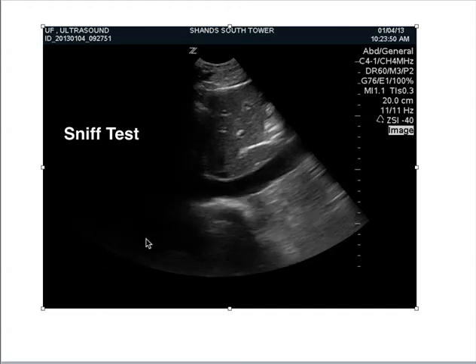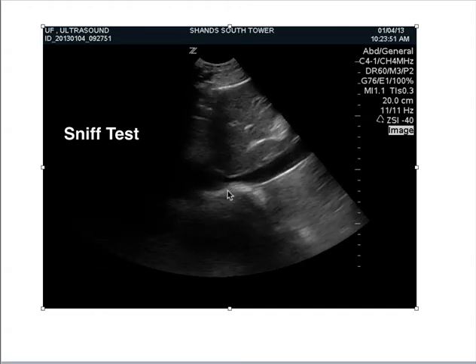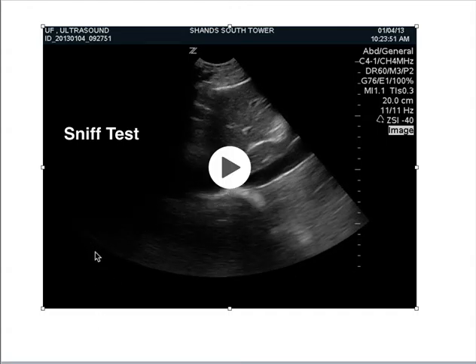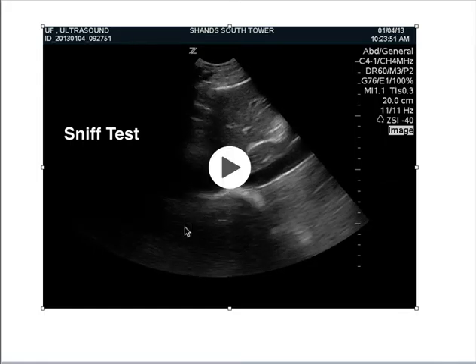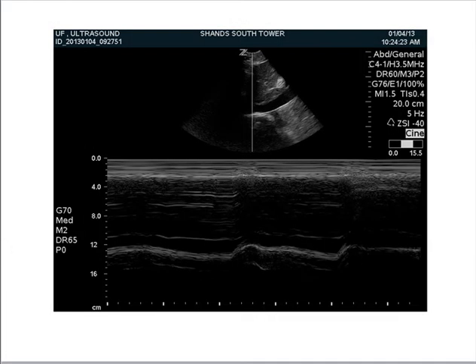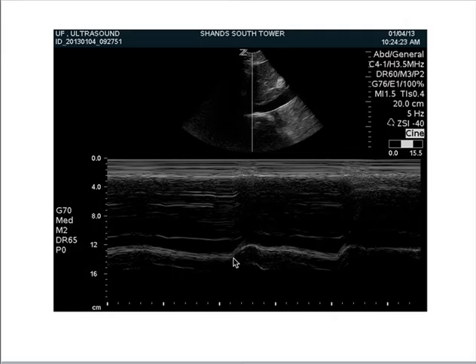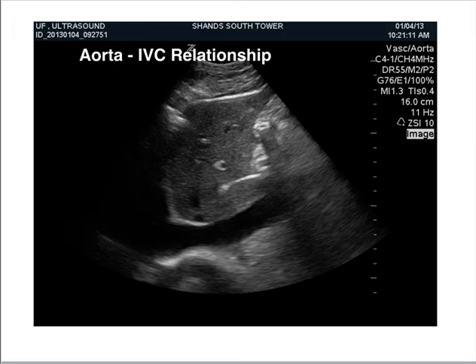Here's a sniff test. You see the person taking a deep sniff, and you can see the IVC collapsing. That can be done, but in most of our patients they're intubated, so it's not easy to do. Here's the M-mode of the sniff test — you can see the sniff happening and the collapse. You can actually measure these out if you're interested in getting exact numbers.